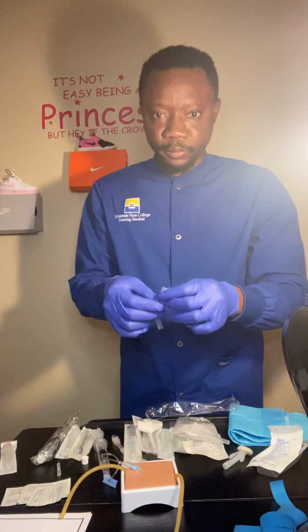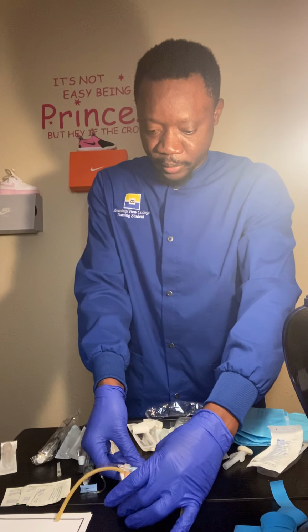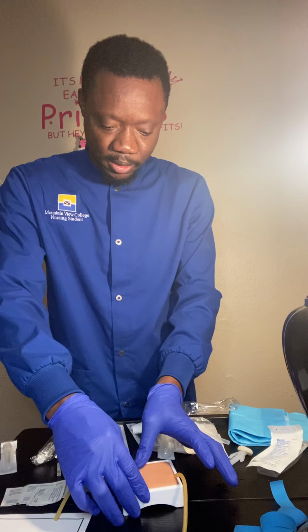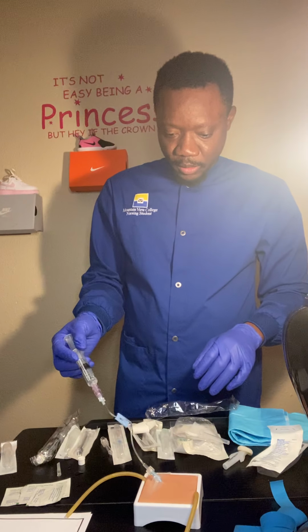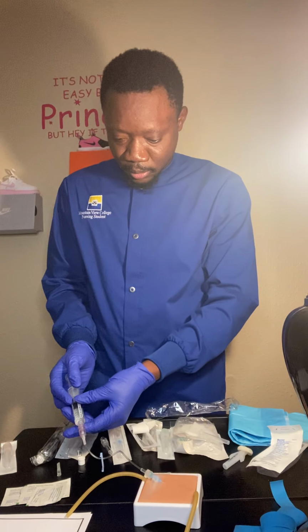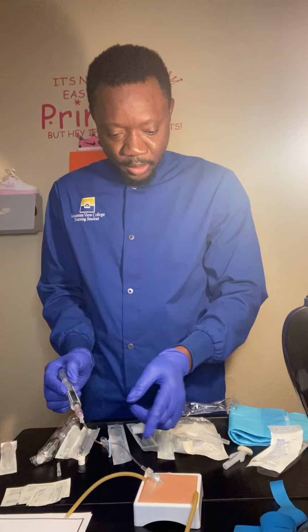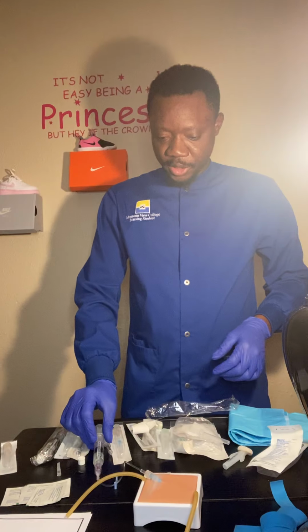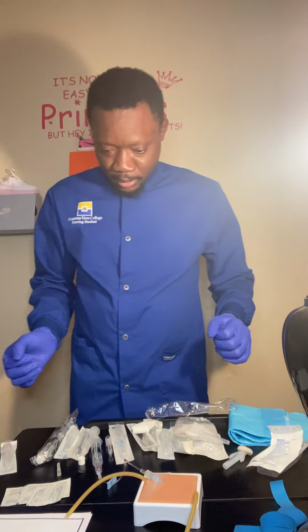They get another tape. Stay on the blue pad, and I make sure that I don't touch the site of insertion to avoid contaminating it. So once I'm done with it, I still have to go ahead and flush 2 ml. Looking at the site and the patient, so it flushes good.